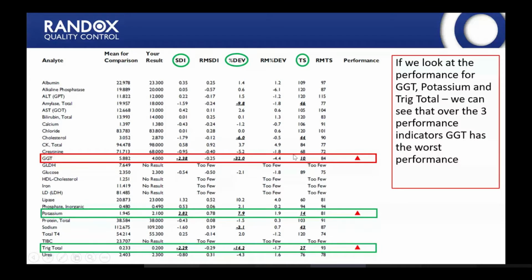So anything here you can see 10 is the worst, 14 is the next, and 27 is the next. On the report page here we can see, if we look at the running mean target scores, whether it's a long-term issue or if it's just this particular sample. For these parameters you can see that the running mean target scores, these ones are in the 80s and this one's in the 90s. So it's not a long-term performance issue. There's a particular issue with this particular sample for these parameters. This is why the summary page is the best place to go to get your initial information on your particular sample, and then we can look at the individual report pages to see what's wrong.